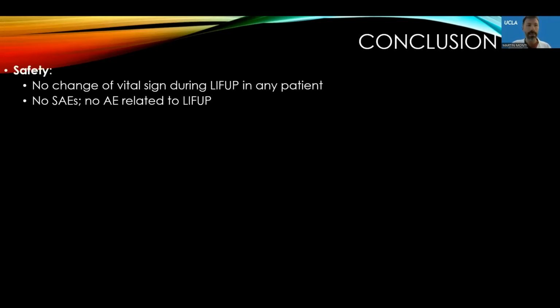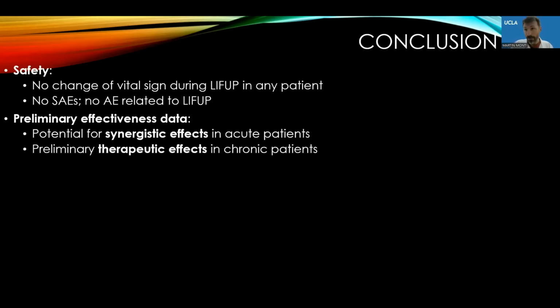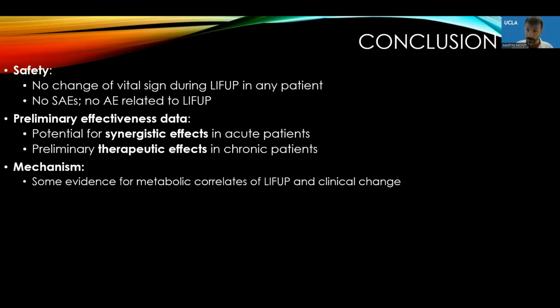So let me just close by saying that overall, in terms of safety, we've had no SAEs. We've had a few adverse events, but they were all related to the procedure, not to ultrasound itself. For example, we've seen a lot of UTIs typically connected with positron emission tomography. In terms of effectiveness, we do see some initial effectiveness, both in the acute and in the chronic cohort. And we start seeing some evidence for a mechanistic link between what we're doing with the ultrasound and the effects that we're observing clinically.